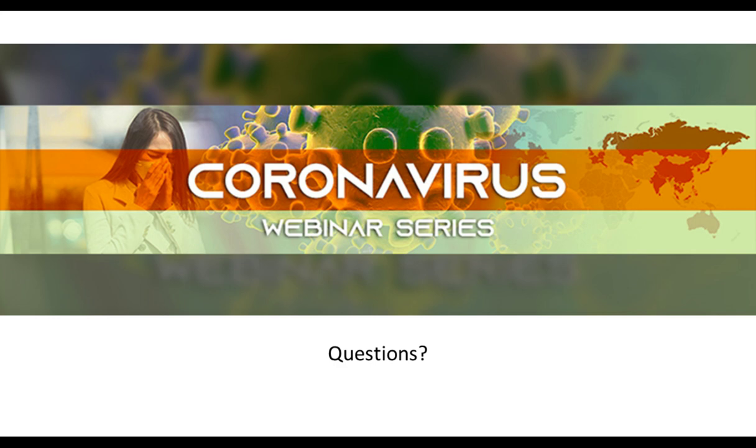Thank you. And Thibaut, do you do sequencing for every sample? So if the question is about what we did in Wuhan, most of the sequencing work was initially sequencing of the genome and then trying to monitor how the growth is and whether there are any mutations. So the short answer is no. Primary testing was done using real-time PCRs. Thank you for that. And kind of continuing with tests, Thibaut, are the 1M tests performed by BGI using RT-PCR or sequencing? Yeah. Most of those tests were done using RT-PCR.